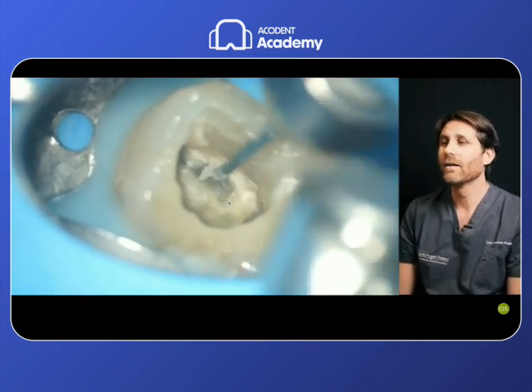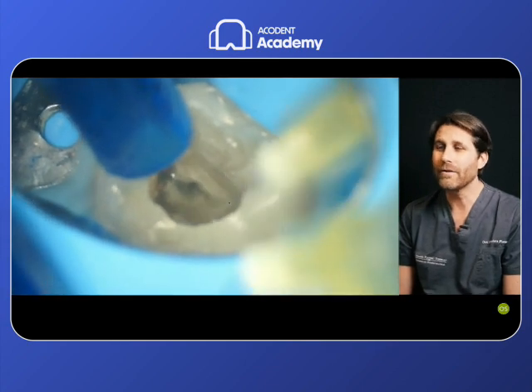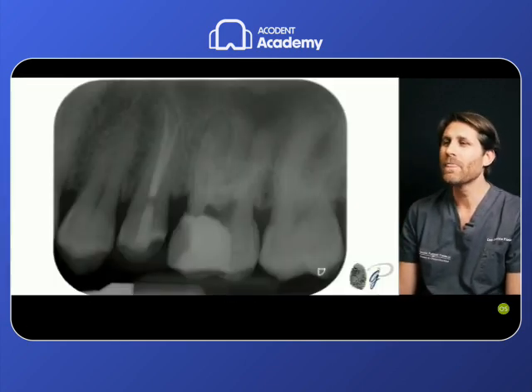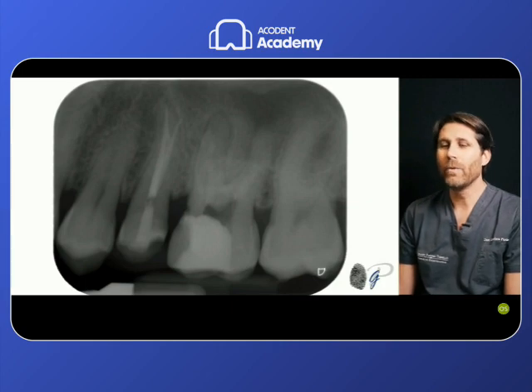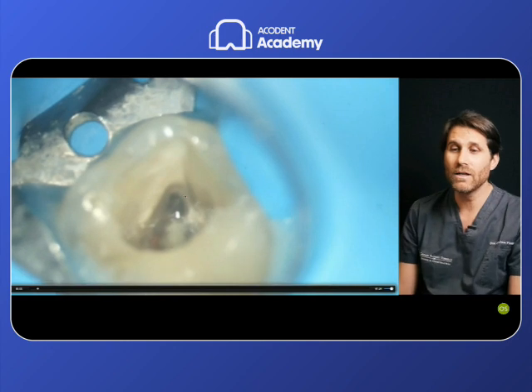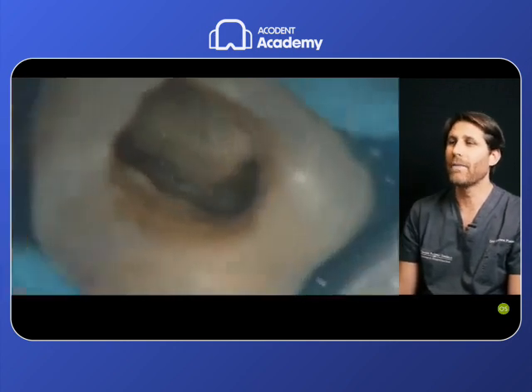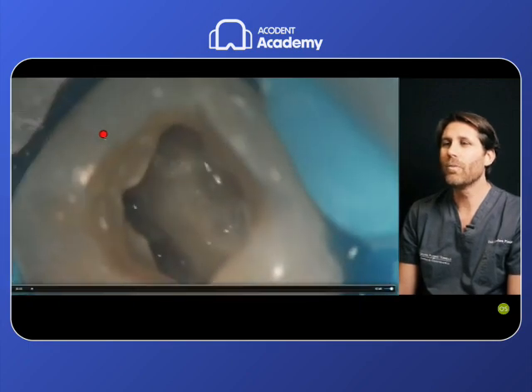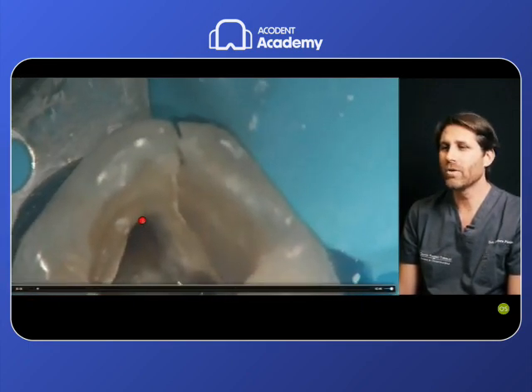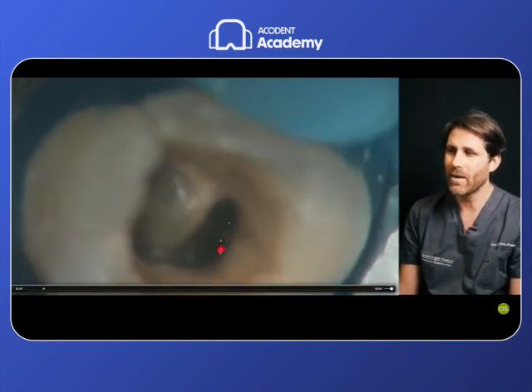In this tooth that was quite particular and quite difficult, we completed the MB2 preparation, and then we finished the MB1, and understood the different anatomies that we can appreciate here. 2 distobuccal canals, distobuccal 1, distobuccal 2, 2 mesiobuccal canals, mesiobuccal 1 and mesiobuccal 2, and 2 palatal canals, palatal 1 and palatal 2.